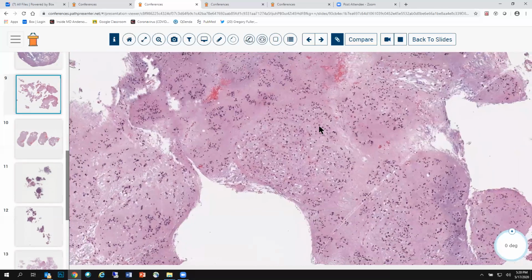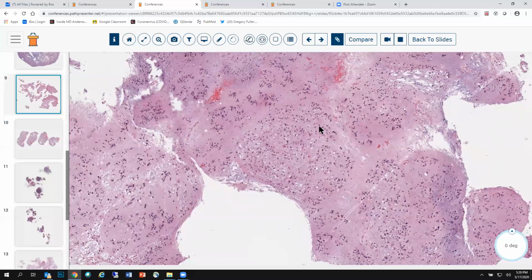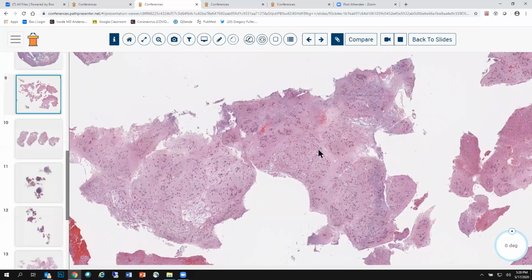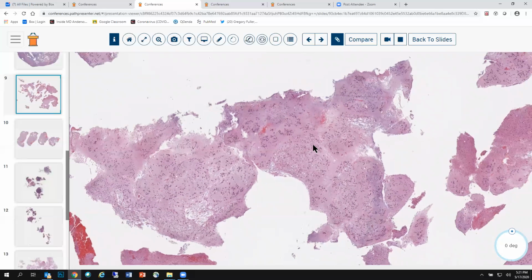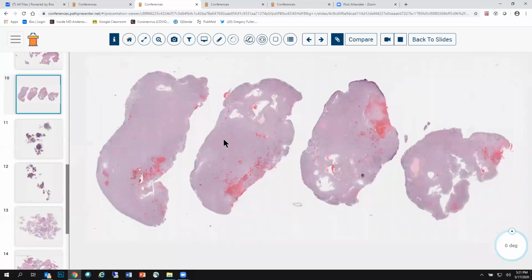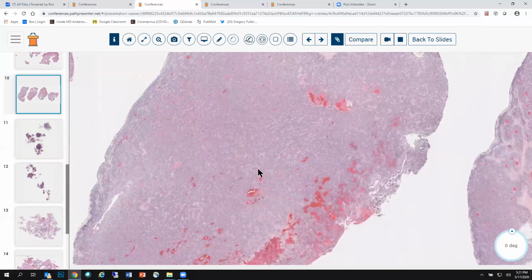Again, compact tumor, no brain parenchyma. If you wondered about brain parenchyma, you could run a neurofilament immunostain. Look for entrapped axons. Again, this tumor is classic subependymoma. Most common location, lateral ventricle to the foramen of Monro and fourth ventricle, blocking the outlet foramina, leading to obstructive hydrocephalus. Third most common location, spinal cord, where they cause symptoms early because of the real estate where they're located, at a small size. Classic subependymoma. All right, moving to the next case, unknown case number 10.